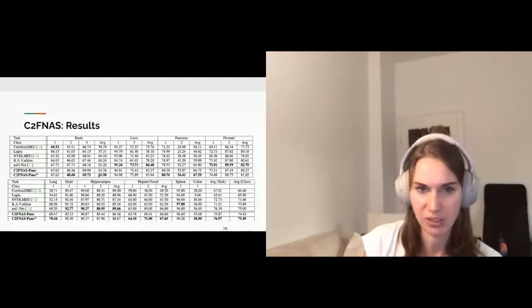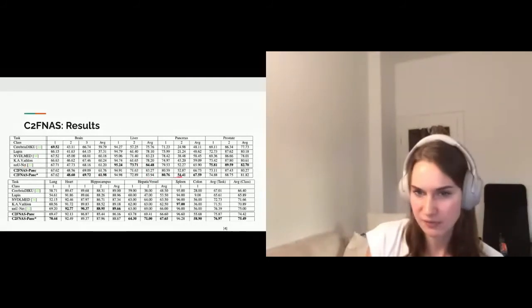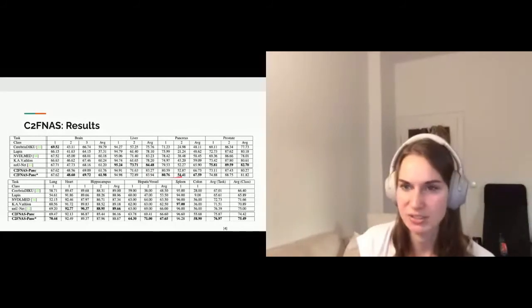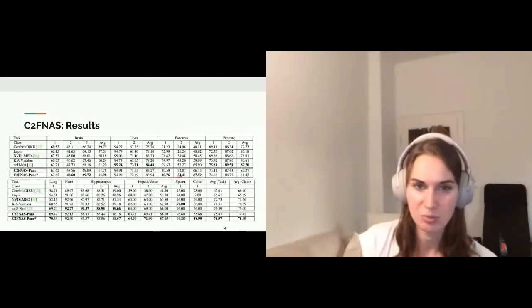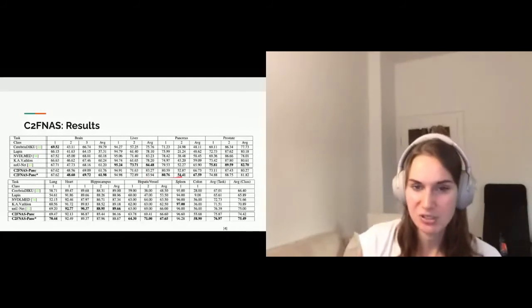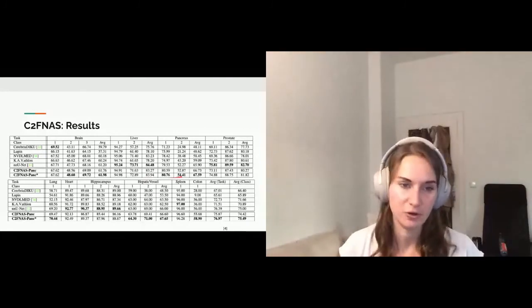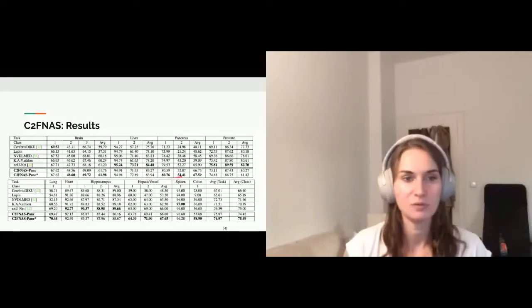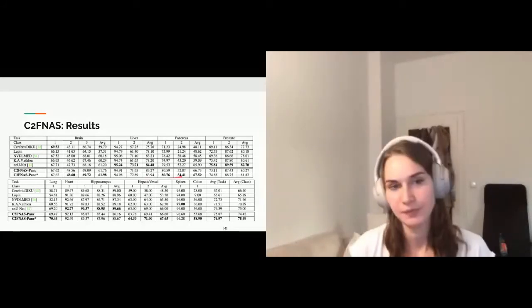They're outperforming this state-of-the-art UNet version. In a lot of the cases, they claim that they're outperforming it in most, but as you can see, it's kind of alternating. And the percentage or the differences in values are super small. So in my opinion, it's not a clear winner, but that's the point they're trying to make.